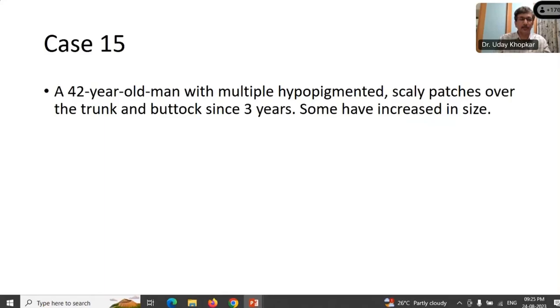Frequently, both the conditions tend to get biopsied in the atrophic phase because the condition is asymptomatic. So they present late in the disease, and so it ends up being in the atrophic phase. So you may not see the classical boxing of the dermis every time. Thank you.